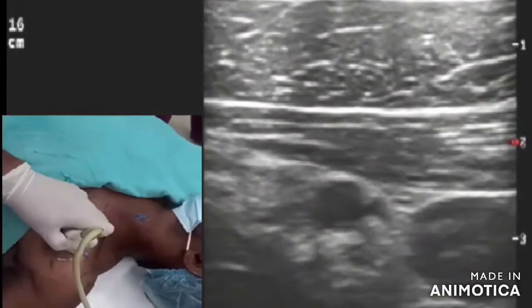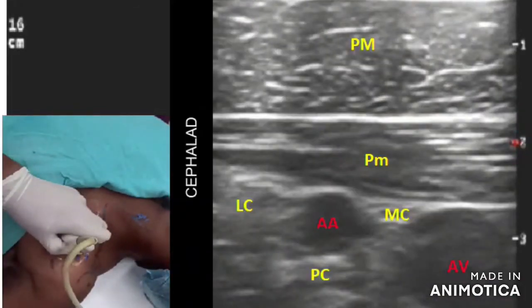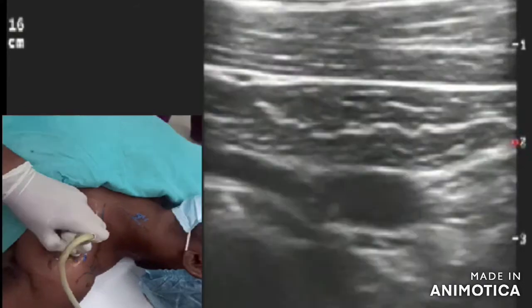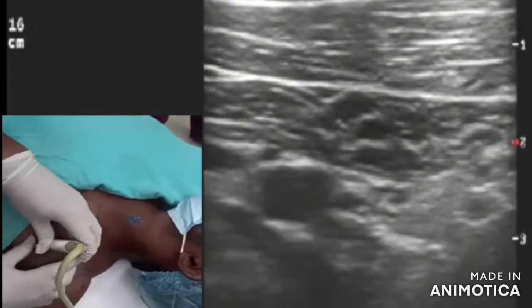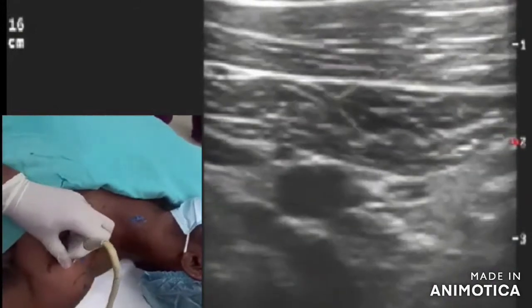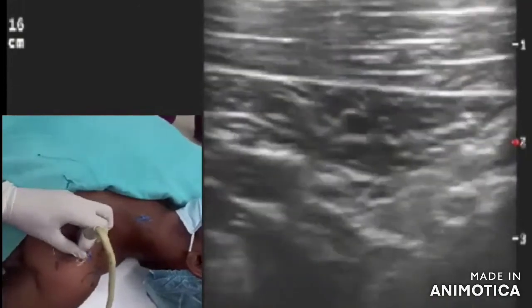In this picture you can see how the probe is tilted in the sagittal direction, and now you can see the lateral, medial, and posterior cords in almost a tripod position. This was demonstrated to show the difference between the medial infraclavicular fossa sonoanatomy and the lateral infraclavicular fossa anatomy. This is how we perform the sonoanatomy — thank you.